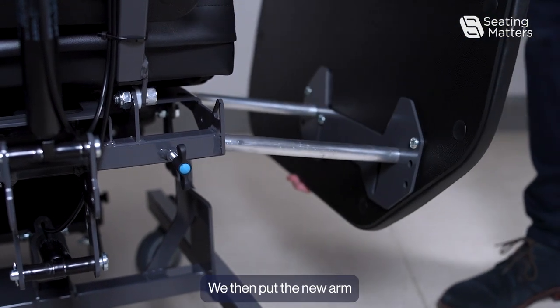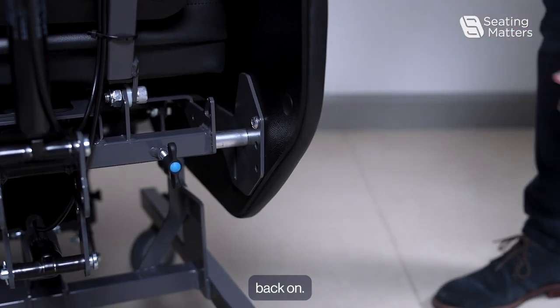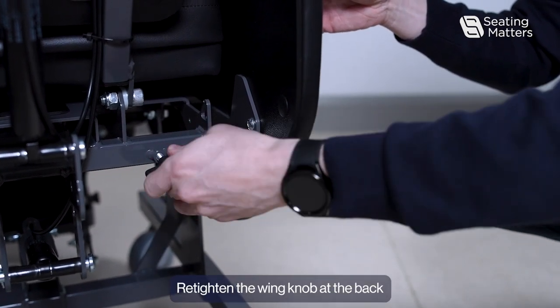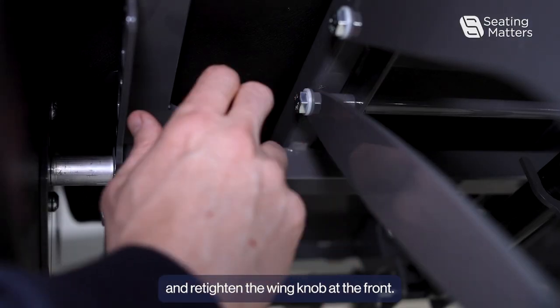We then put the new arm back on, re-tighten the wing knob at the back, and re-tighten the wing knob at the front.